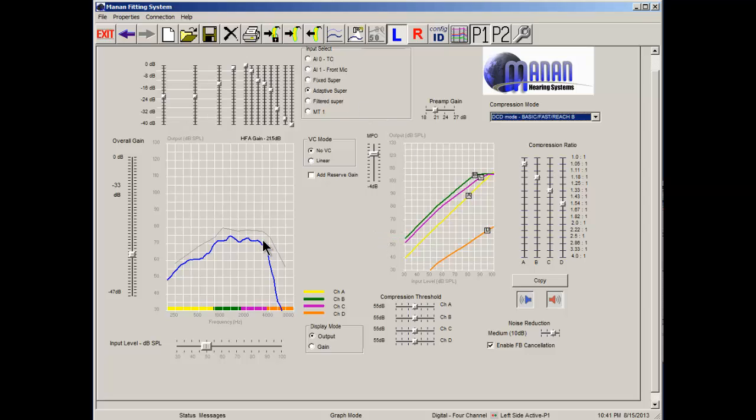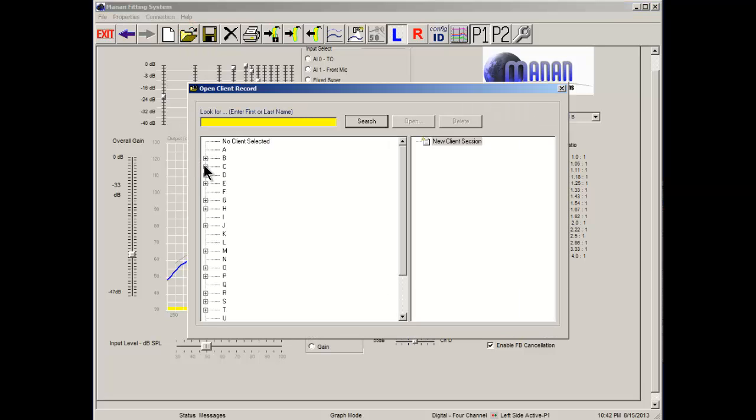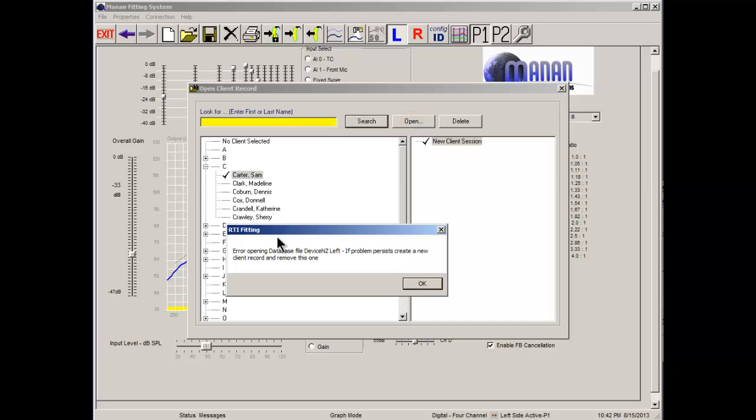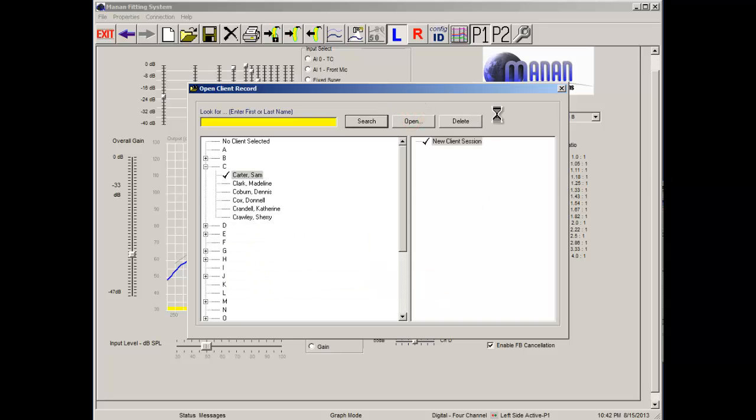So while you're in the fitting screen, you're going to click on the open client button here, and you're going to click on the file. We're using Sam Carter. I'm going to click on an old fitting data. This is basically that backed up data I want to pull into that hearing aid. So I'm going to click open. You get the error message. I'm going to hit OK. I'm going to close down this box by clicking that upper right hand X with my loading icon.